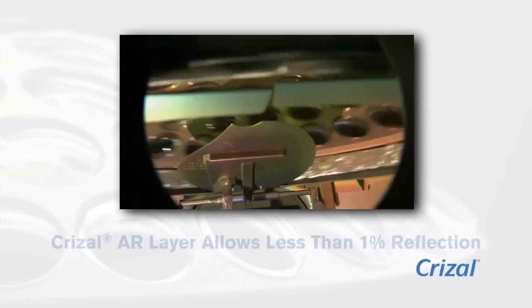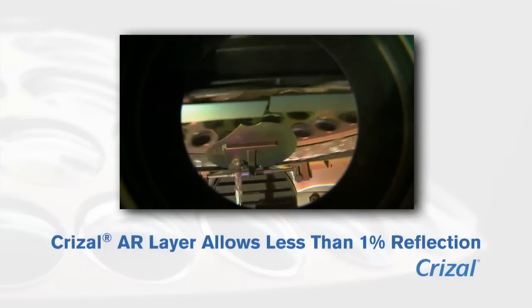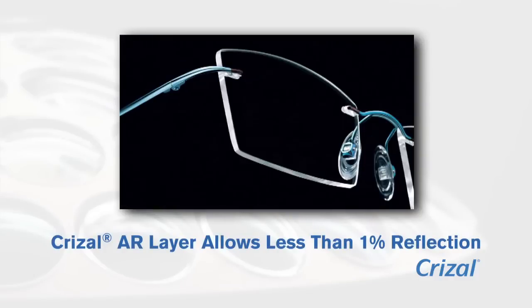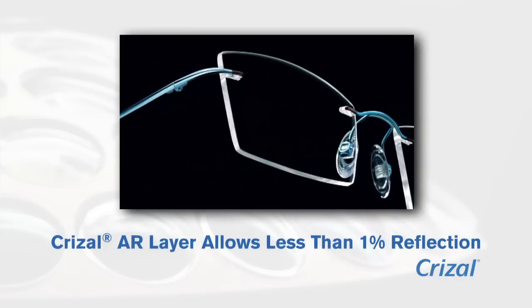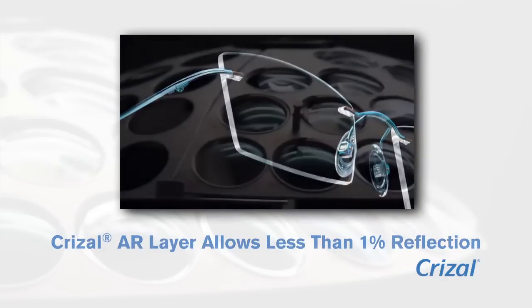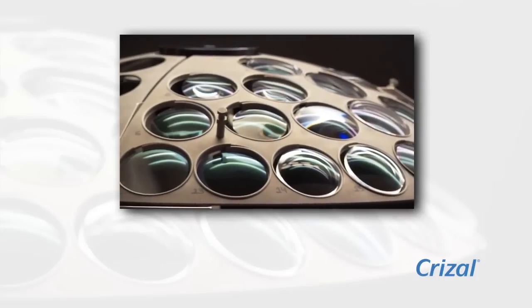Application of the proprietary Crizal AR layer allows our lenses to have less than 1% reflection, a significant improvement over standard lenses.